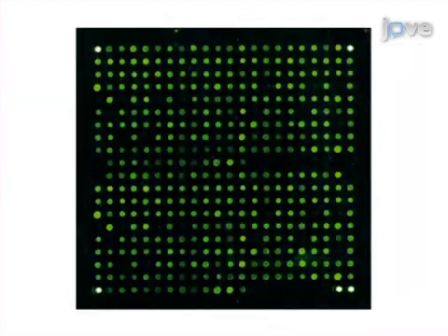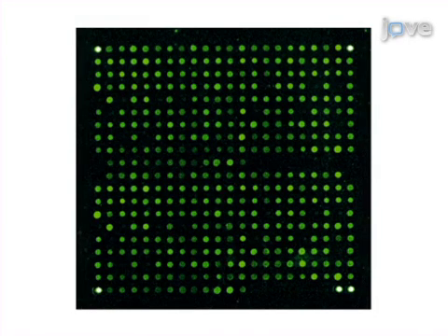The final step is laser microdissection in order to separate invading tumor cells from non-invading tumor cells and cancer-associated stromal cells. Ultimately, molecular profiling techniques may be used to characterize the biology of invading and non-invading tumor cells and stromal cells in the surrounding tumor microenvironment.